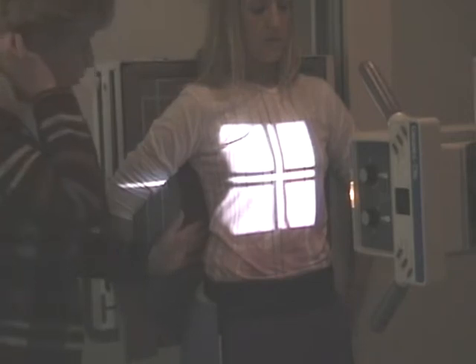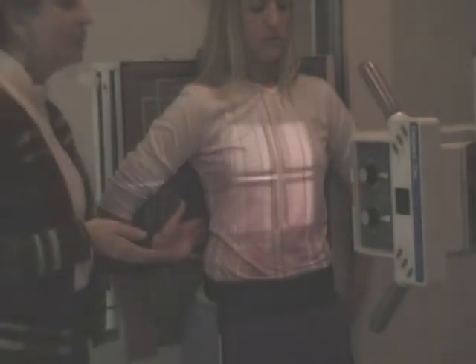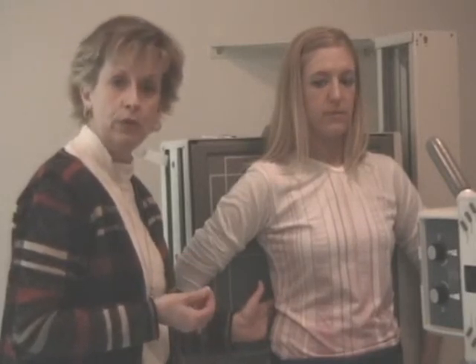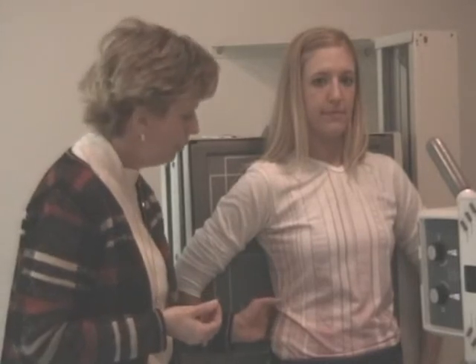And now, if we're after below diaphragm ribs, you want to elevate the diaphragm. And to do so, you have them take in a breath and blow it out. And this time you want expiration. Blow all your breath out. Please hold it out. Don't breathe or don't move. And you can make your exposure.